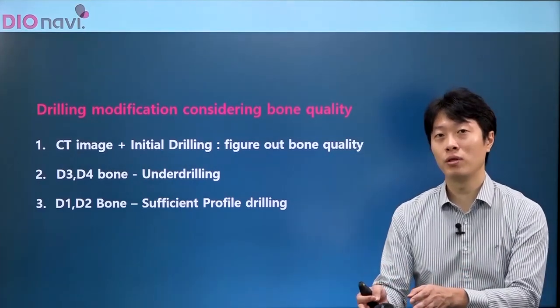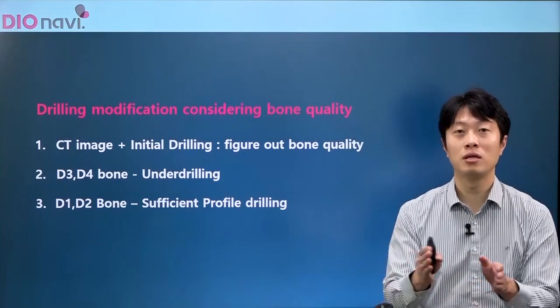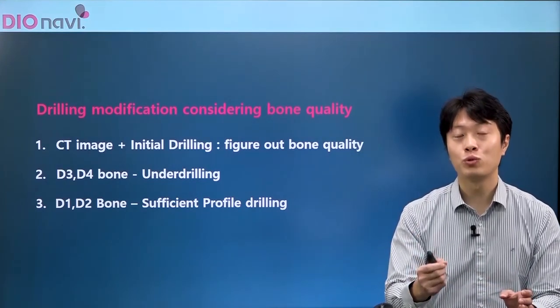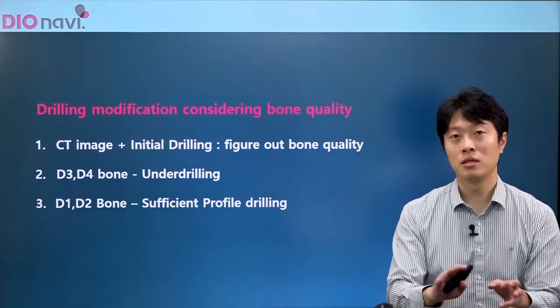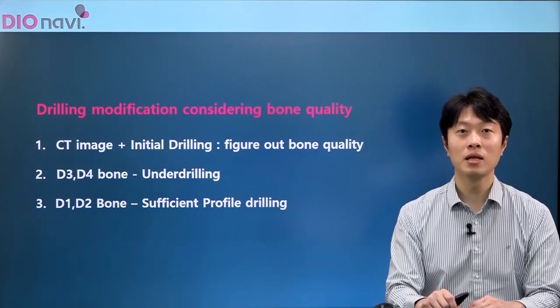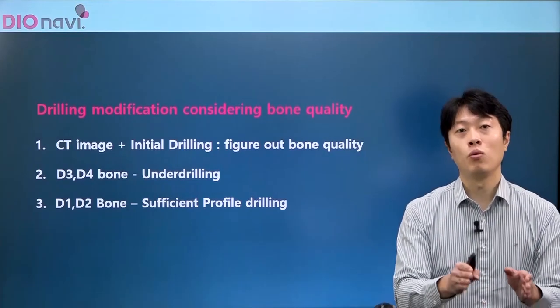Try this process a few times with the touch during initial drilling. You will get a sense as to which extent drilling is to be done. Later on, even when you rely on such feelings, you will have gathered enough information on how much of underdrilling should be done, which will help you proceed without trial and error. That's why you should underdrill when the bone quality is poor.